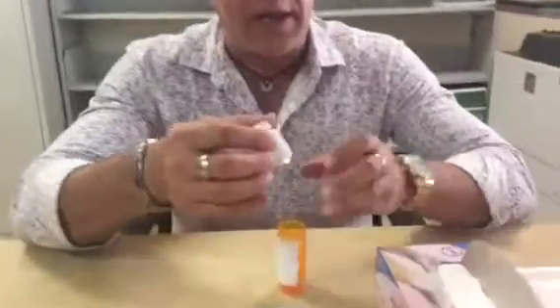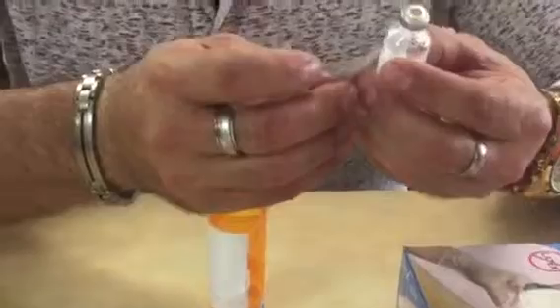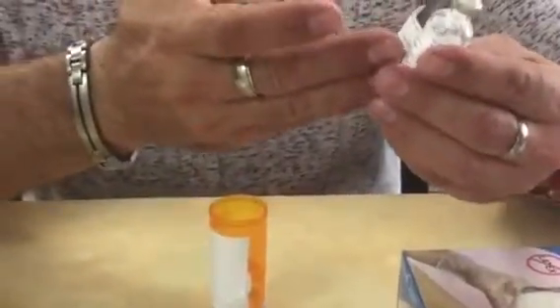We are not doing that during this process, but it's very important to keep in mind to wash hands with soap and water. Check the insulin bottle, make sure that it is the correct dose, that the medication is not expired, and that it is the correct medication.